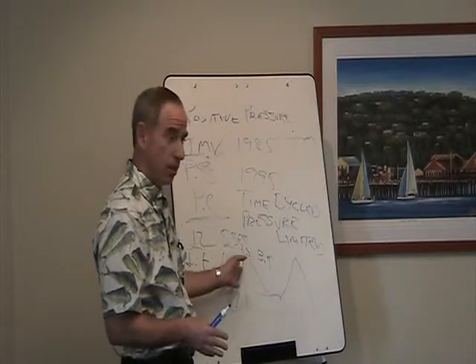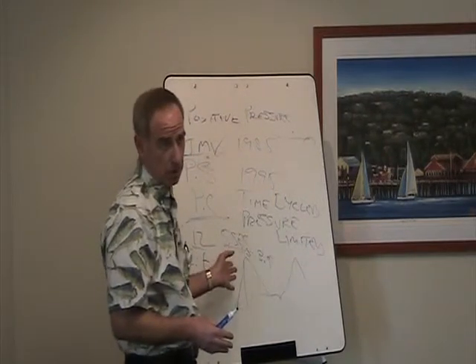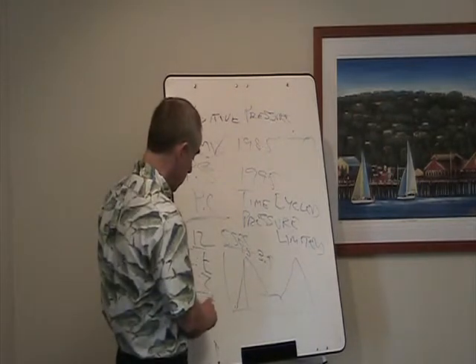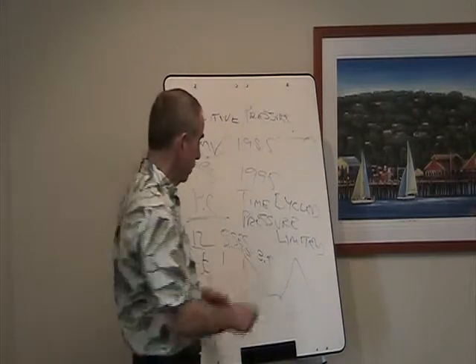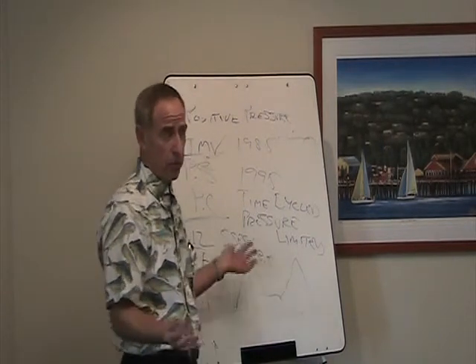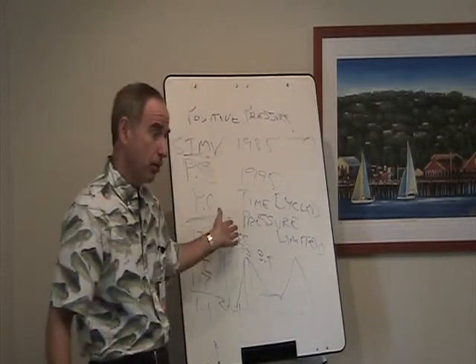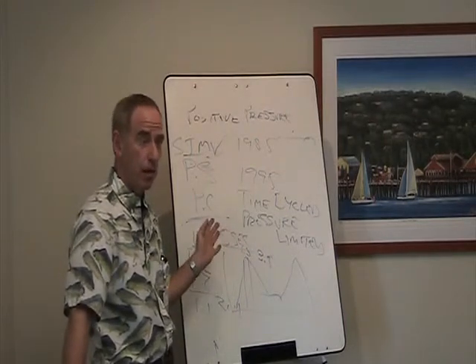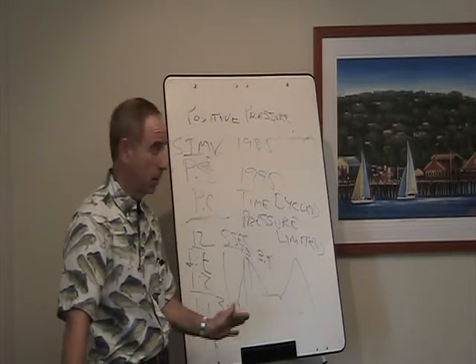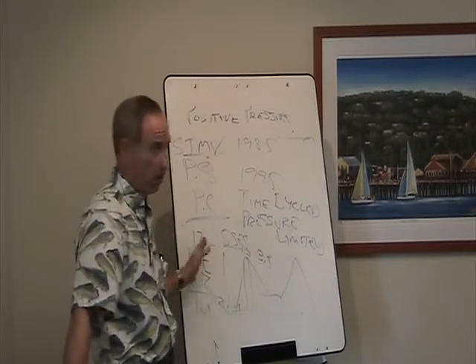Well, by adjusting the inspiratory time, what if we make the inspiratory time longer? Then what's going to happen to your IE ratio? It's going to allow less time for exhalation, right? So your IE ratio is going to go to maybe 1 to 1. So maybe I'm going to now have 2.5 second inspiratory time and a 2.5 second expiratory time. Or say I want to have what's called inverse ratio respiration, where I want to have a 2 to 1 ratio. Then I can do that with pressure control because I can set the inspiratory time at whatever I want. So you can tell it, I want a 2 second inspiratory time, or you can say, I want a 2 to 1 ratio, and it will automatically calculate the time based on the rate that you've set.